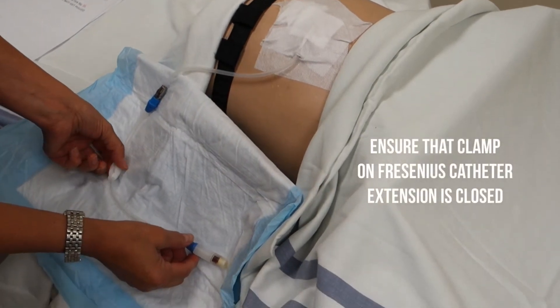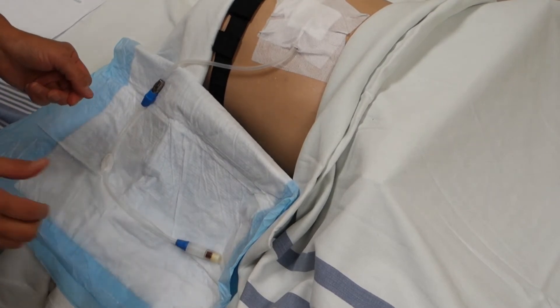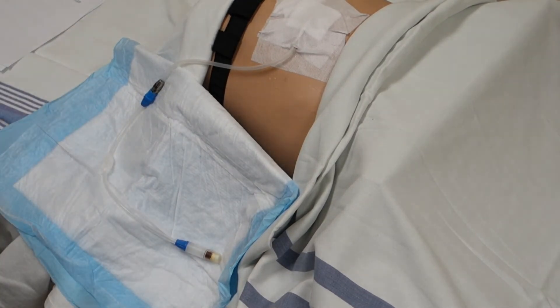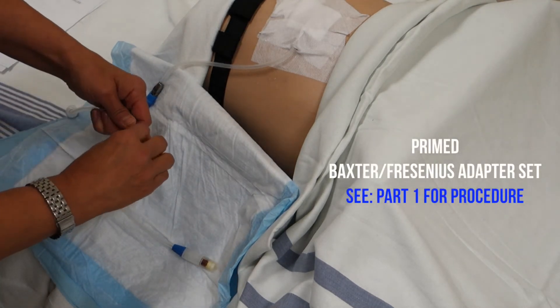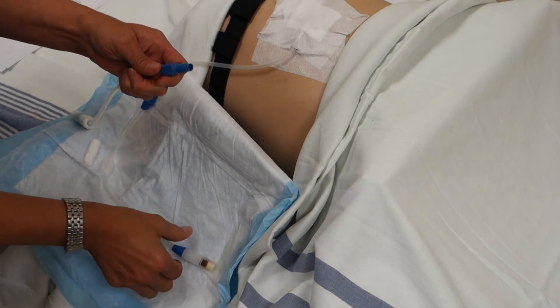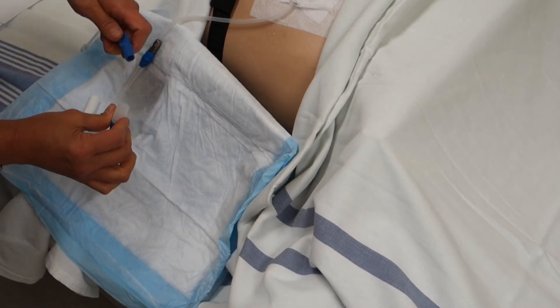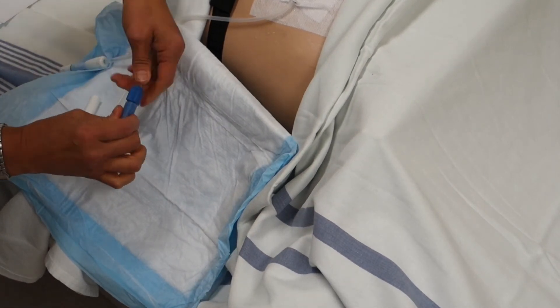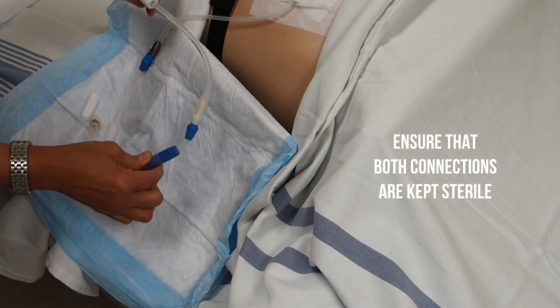Ensure that the clamp on your Fresenius catheter extension is clamped. Then you will take your primed Baxter adapter set and remove the white cap from the adapter and the disinfection cap from the Fresenius catheter extension, and screw both connections together, ensuring that both connections are kept sterile.